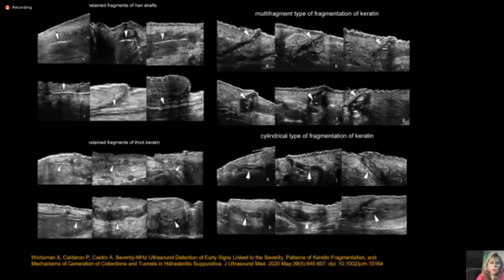We found that these multifragment and cylindrical types of fragmentation are associated to different types of lesions.